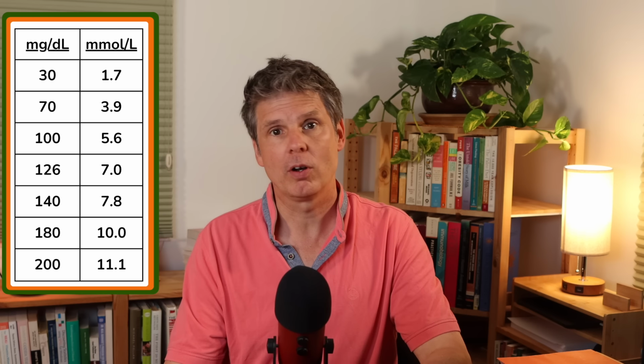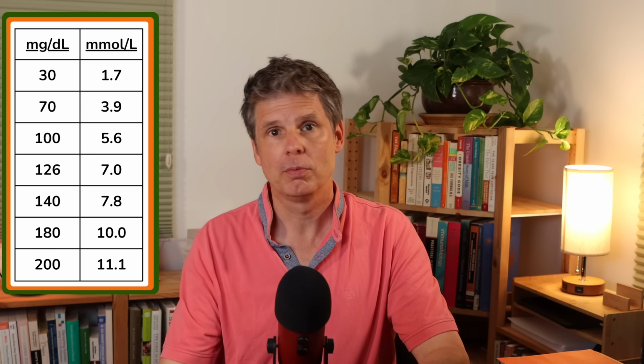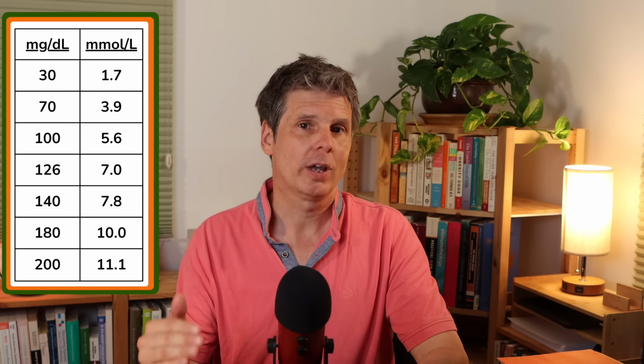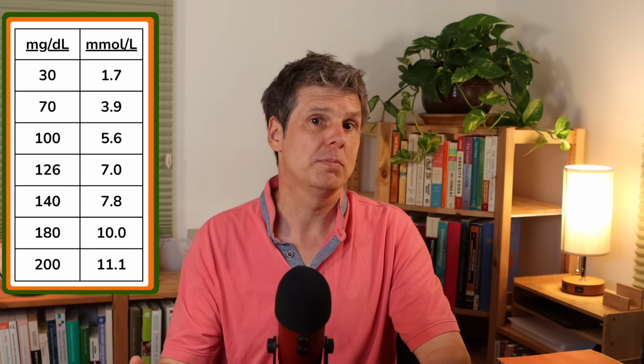Now, the 30 milligram per deciliter figure is the average increase in blood sugar whenever there is any increase in blood sugar beyond a certain threshold. In other words, to calculate MAGE, researchers don't even pay attention to whether a meal was eaten or not. They just look at the CGM data, and anytime the glucose concentration rises by more than, say, 10 milligrams per deciliter above the baseline, they call this a glycemic excursion.